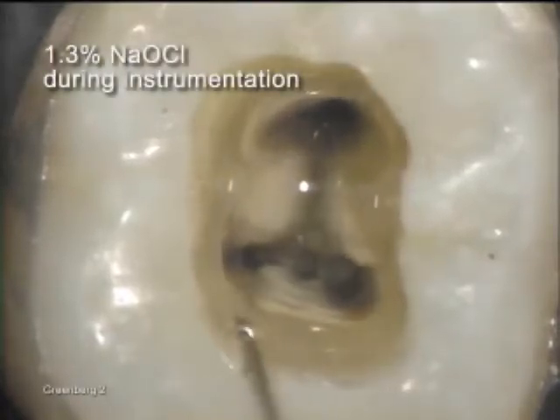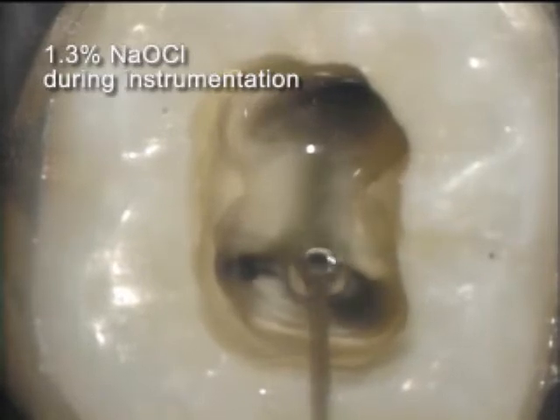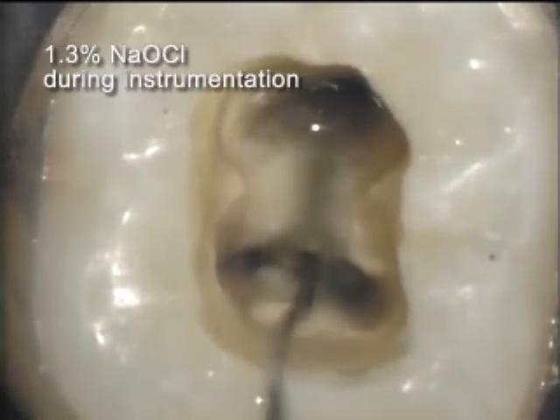This molar was instrumented with ProTaper instruments. 1.3% sodium hypochlorite was used throughout.